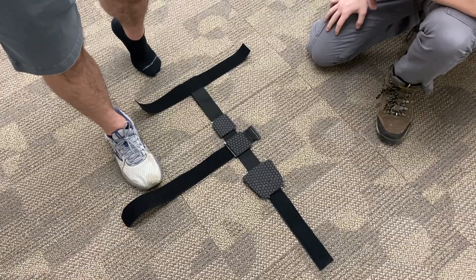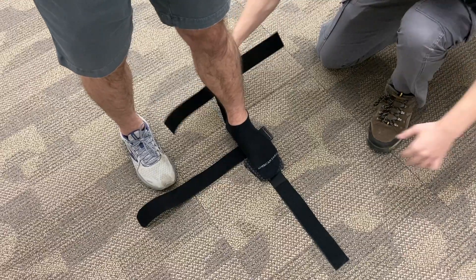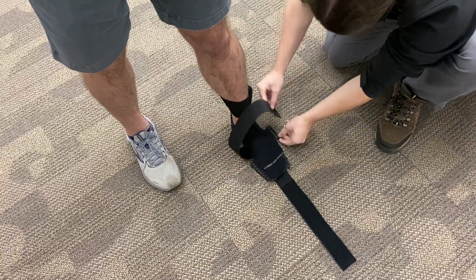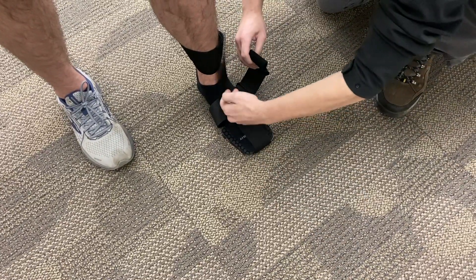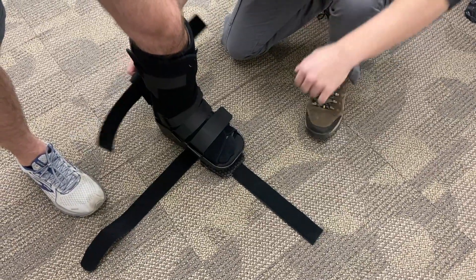First, the device will be laid out flat and the patient will step on the sensing sections. If the outer toe section is needed, it will be added and the sections will be moved to fit the user. Then the therapist will fasten the Velcro band around the ankle and the middle strap over the top of the foot. Finally, the user will bring the front of the main strap over their foot and use the Velcro to fasten that strap in place. The process is the same if the patient is wearing a boot.